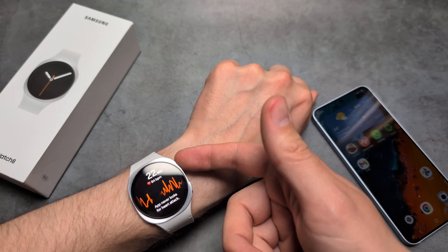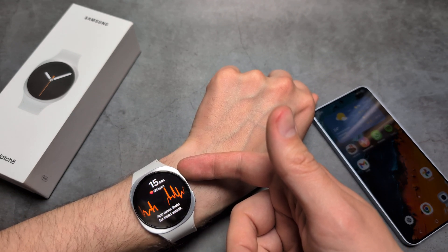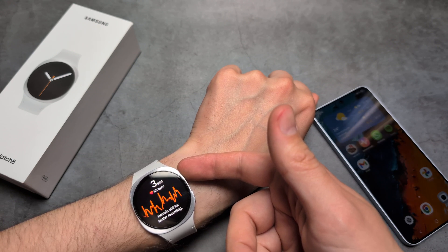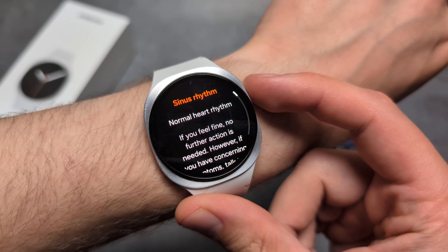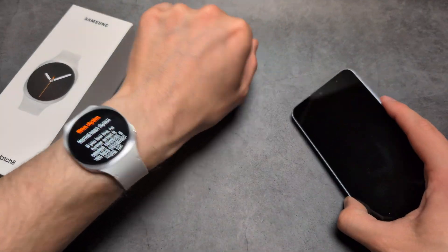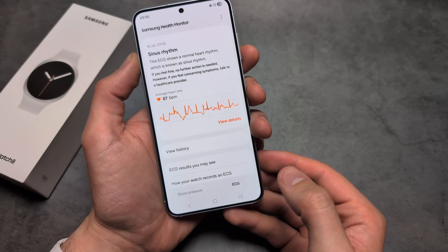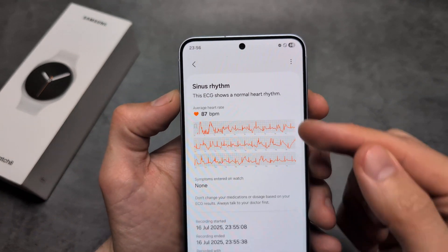Rest your arm on a table like this and simply wait till it finishes. Okay, so you can see this is what it says for me. We can also see the details on our phone in the Samsung Health Monitor app. Over here you will see your ECG tab and your result, and you can also see your history.